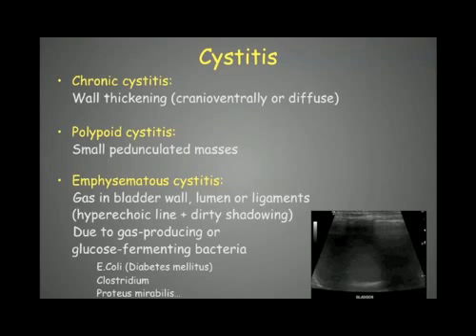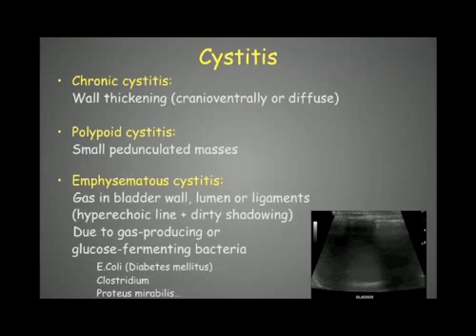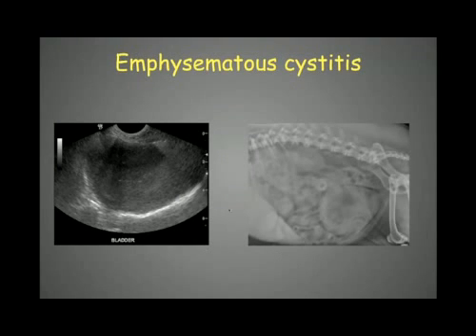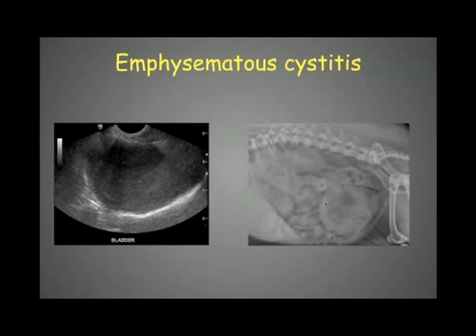Gas can be difficult to see because it creates, like we have here, a hyperechoic line and then some dirty shadowing underneath — a typical gas pattern like we can see in the GI tract. The problem with the bladder is that there are many artifacts with reverberations, and it can be difficult to differentiate between those reverberations and gas. We can change the position of the dog to see if the gas is moving. If we still have doubt, we can take a radiograph where the gas will appear clearly in the bladder wall and lumen.